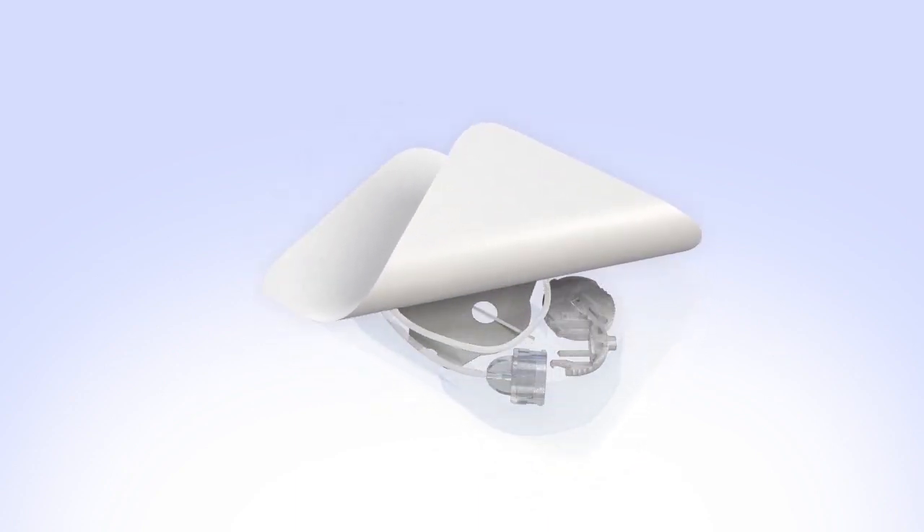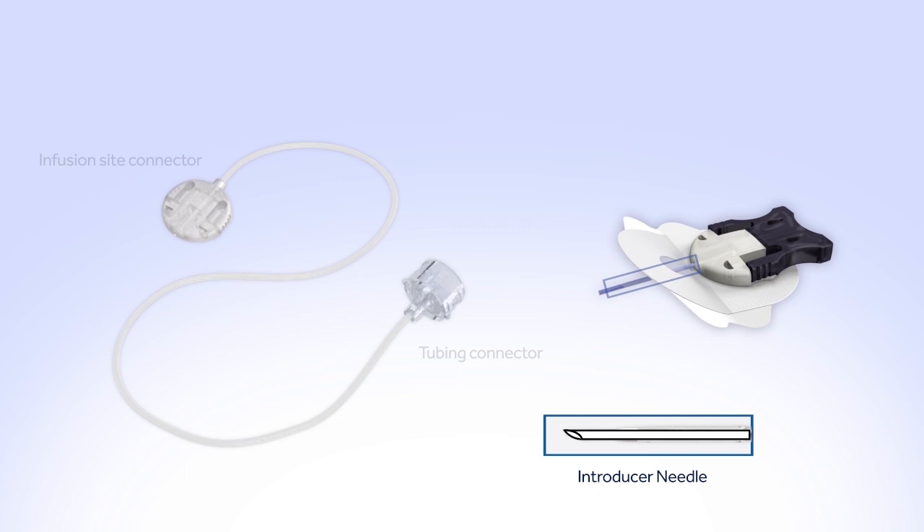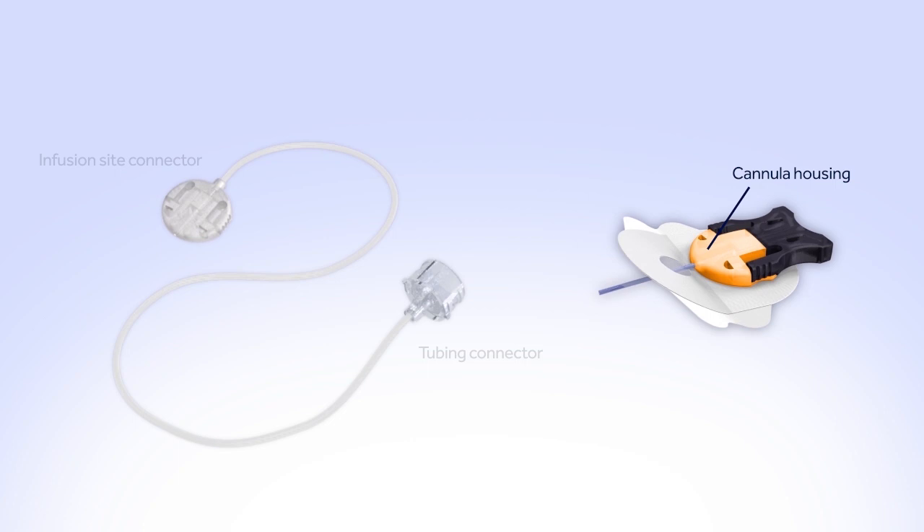Remove the infusion set from the package. Let's review the parts of the infusion set. The Silhouette comes in two separate pieces: one piece is a length of tubing with two connectors on either end, and the other is the insertion piece. On one end of the tubing is the tubing connector that attaches the infusion set to the reservoir. On the other end is the infusion site connector that attaches to the insertion piece. An introducer needle is used to insert the soft, thin cannula into your body; it is removed after the cannula is inserted. The cannula is a thin, flexible tube that surrounds the introducer needle and, once inserted, will deliver insulin into your body. The cannula housing holds the cannula and insertion needle and allows you to disconnect at the infusion site. A paper backing covers the adhesive, which sticks the infusion set to your body.